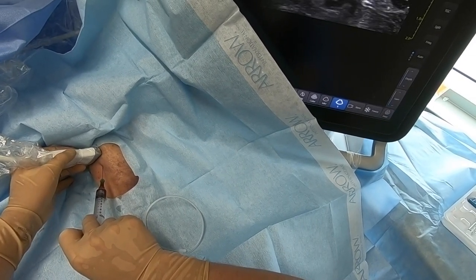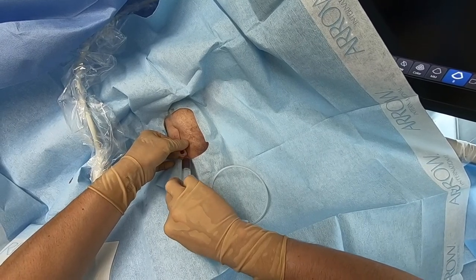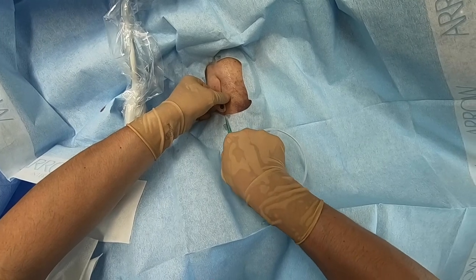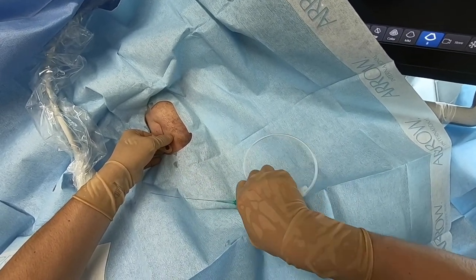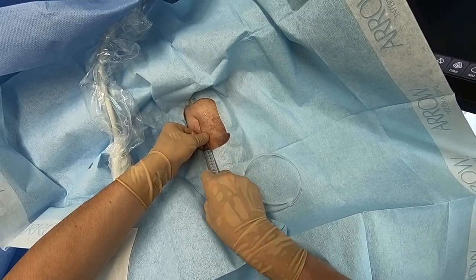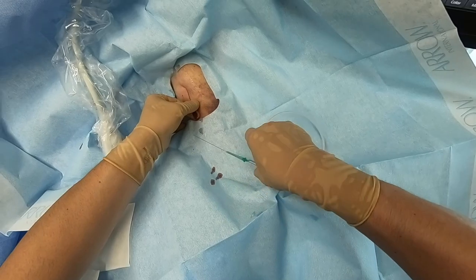The basilic is easier to manage because it's farther away from that brachial bundle, but is not always viable. We have flash now — you see continuous reflux of blood. We're going to stabilize the needle, remove the syringe, and attempt to pass the small wire that comes in the kit. Instead of thumbing the whole thing in, we thumb in just a portion, and once it's captured by the needle, we try to pump the rest of it in with our arm. It does not pass, so rather than force it, we remove it, reapply our syringe, and make sure we still have aspiration of blood, proving we're intraluminal. We do not, so we're going to adjust — the first adjustment should always be withdrawing a bit because you tend to go too deep. We do that, now we have blood again.